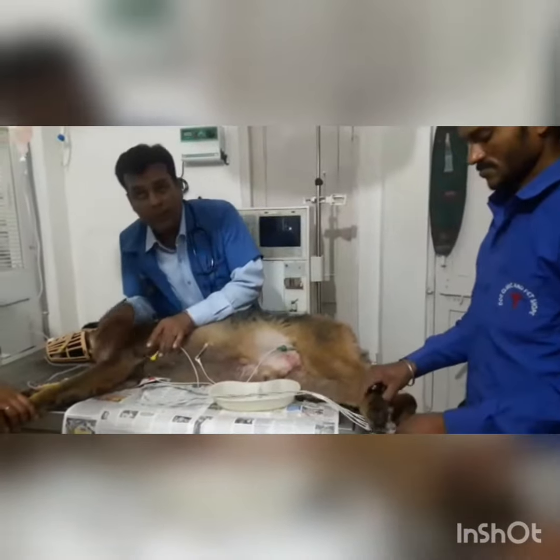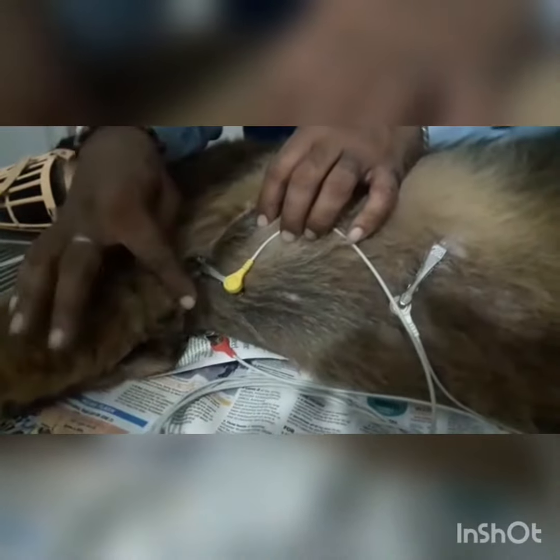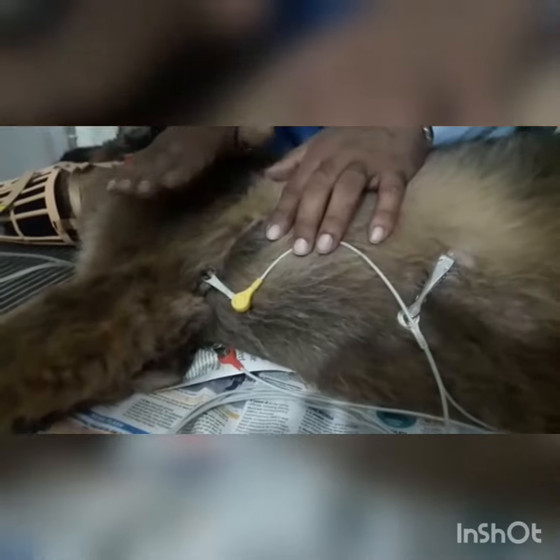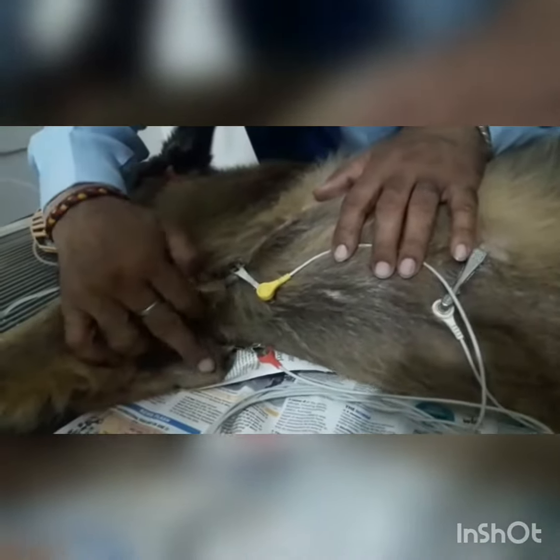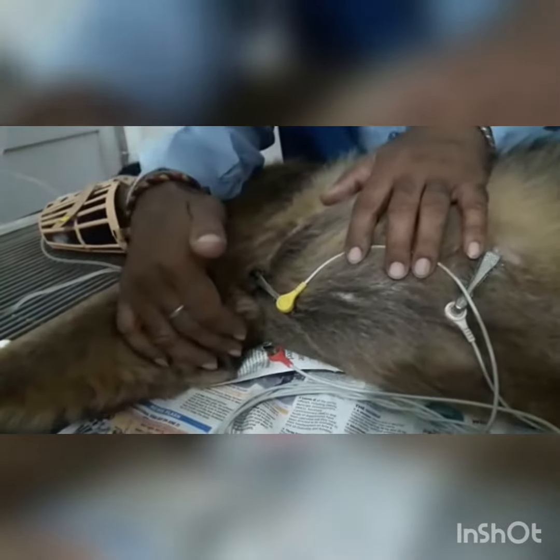This is the yellow clip, which I have applied near the elbow of the left foreleg. First I apply some spirit and gel so that there will be a good connection between the clip and the skin. This is the yellow clip for the left foreleg, and this is the red clip which I have applied near the elbow of the right foreleg.